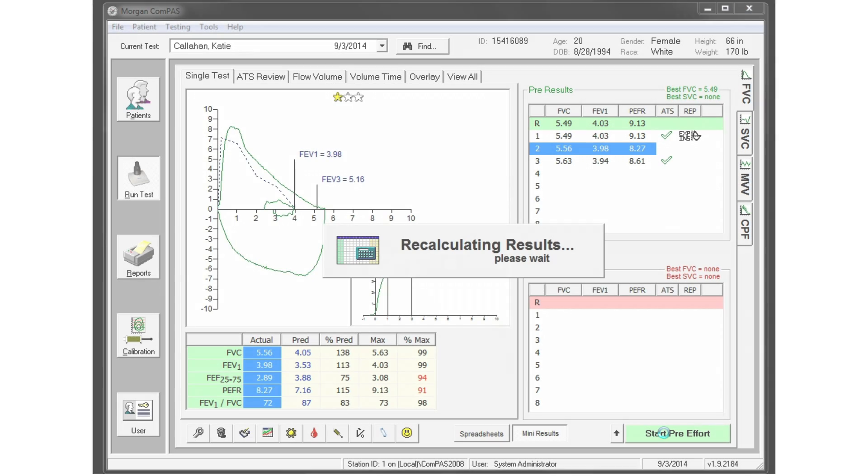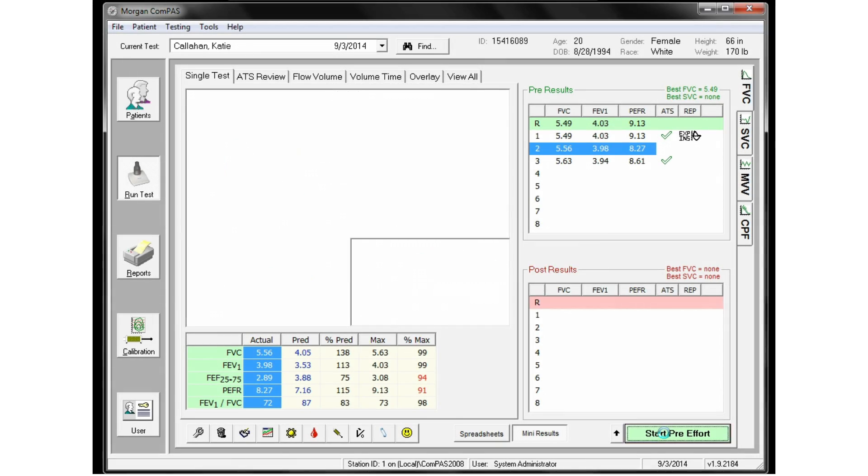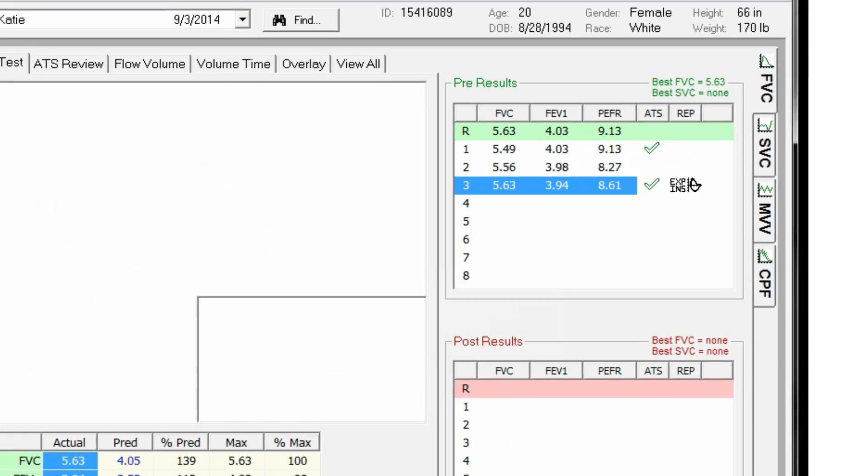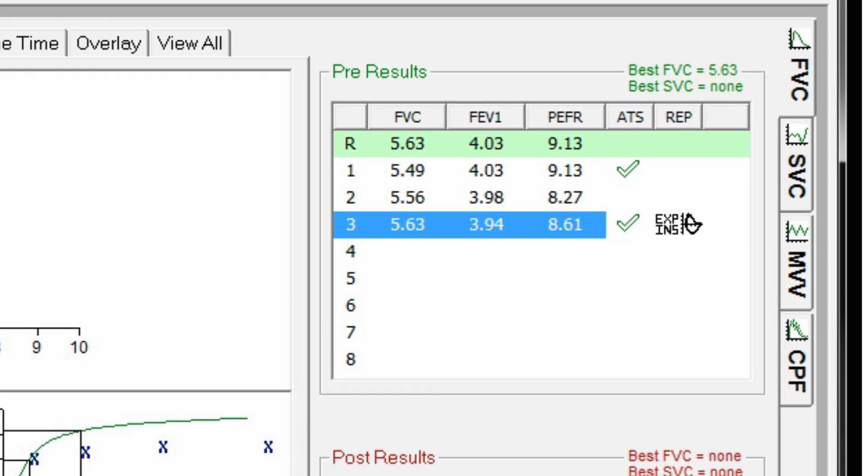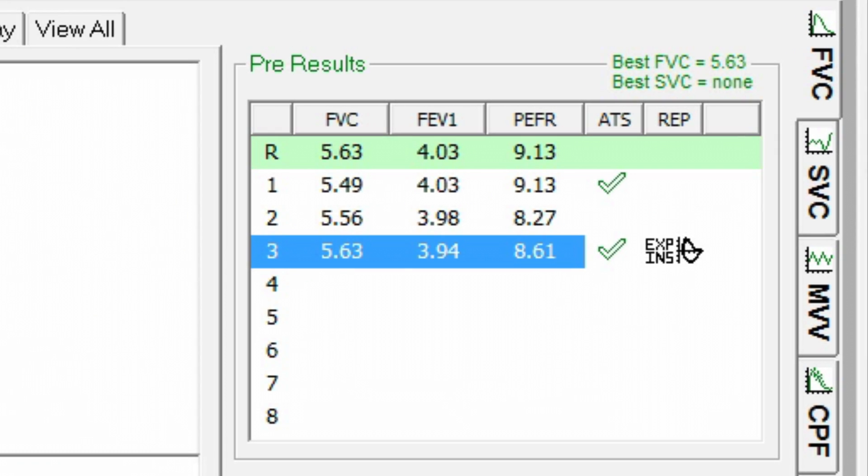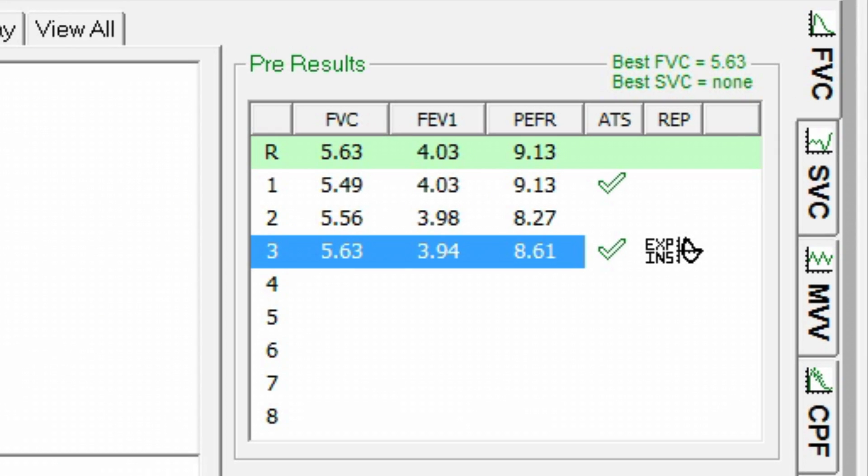Tests are evaluated for ATS acceptability and reproducibility. A hollow checkmark indicates an ATS acceptable effort.